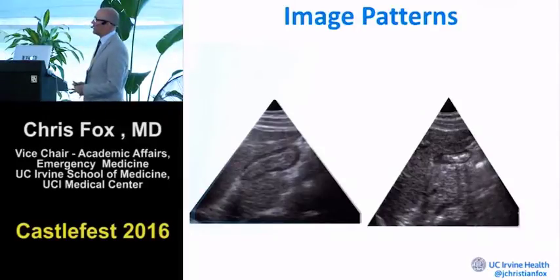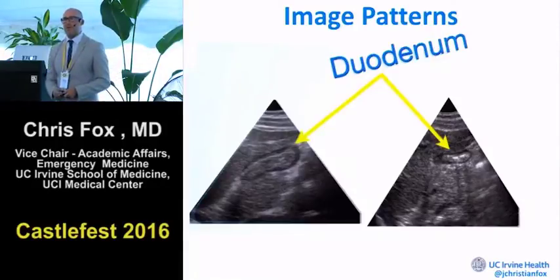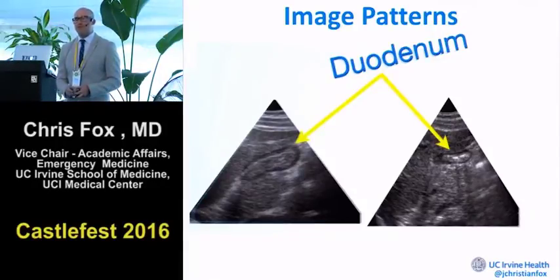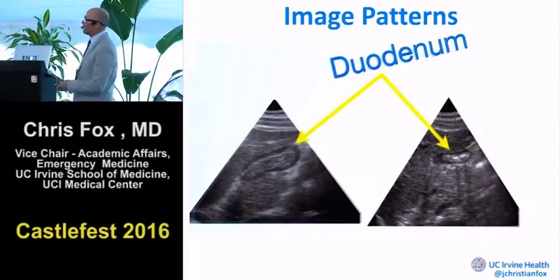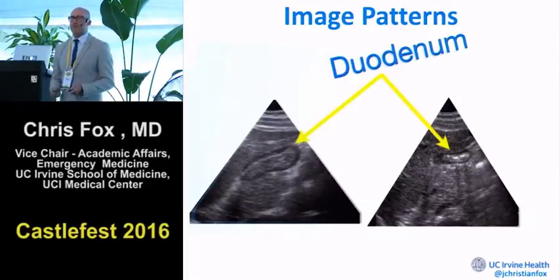Again, the conundrum. What are we looking at on these images over here? This looks a lot like a contracted gallbladder, doesn't it, with sludge in it? Maybe over here we see a contracted gallbladder with stone and some shadowing. What do you think? It's the duodenum, not the gallbladder. So that's the whole problem here, is that duodenum can really look like the gallbladder sometimes. And as it's contracting, what you'll see is live peristalsis. And then here's the other dead giveaway: the outer wall of all of the loops of bowel in our body, from our esophagus all the way down to our rectum, they all have this hypoechoic surrounding around the outside of it. That's how I know that that's a loop of bowel. So it peristalses and it's hypoechoic there.